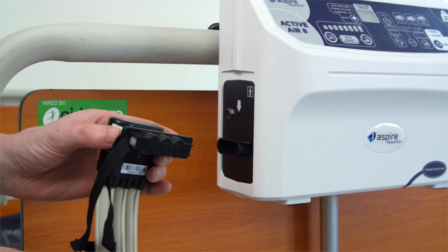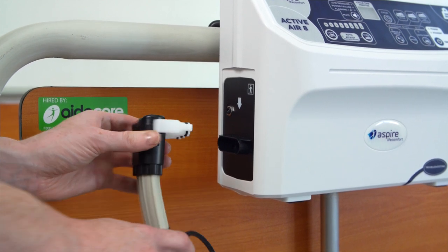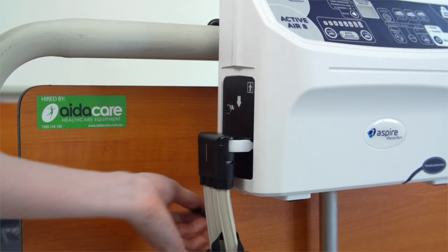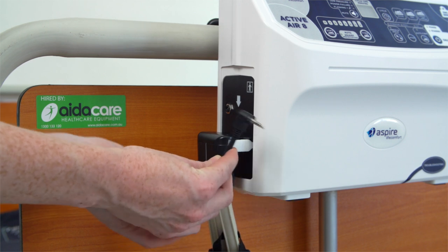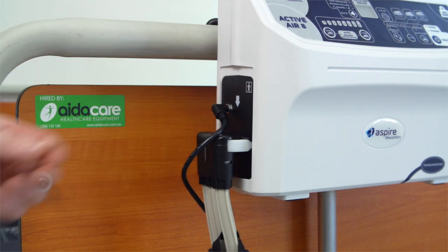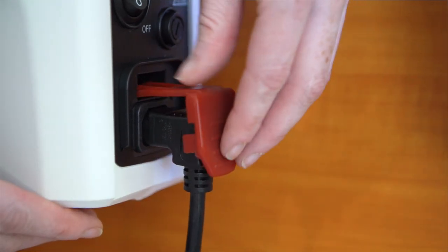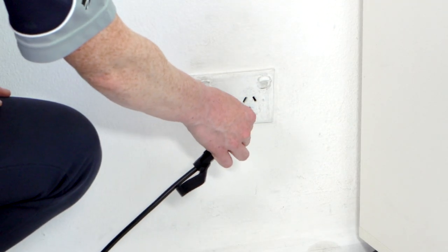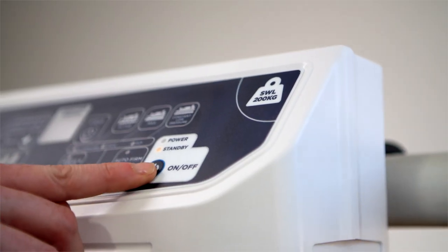Hang the pump on the foot end of the bed and remove the plastic protector cap from the air hose. Connect the air hose to the pump — you will feel a click. Some mattresses like the Active Air 8 have an additional sensor cable; also connect this to the pump. Then connect the mains power cable, click the red power cord protector into place, plug the mains power cable in, turn the power switch on, and press the on button on the control panel.